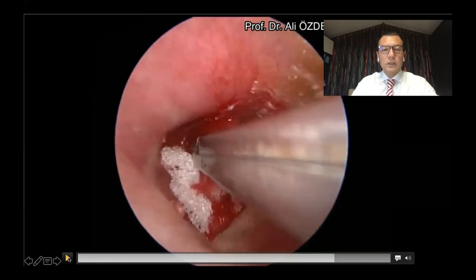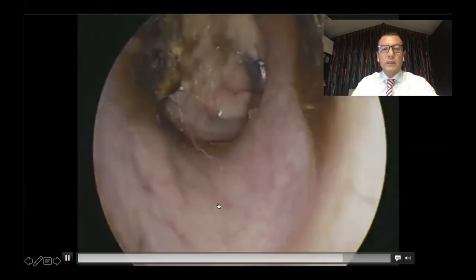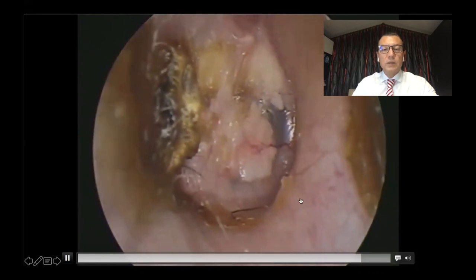This surgery is very suitable for small perforations, and wound healing is very rapid with this technique. We can see the postoperative results of the patient after eight months — there is no tympanic membrane perforation.